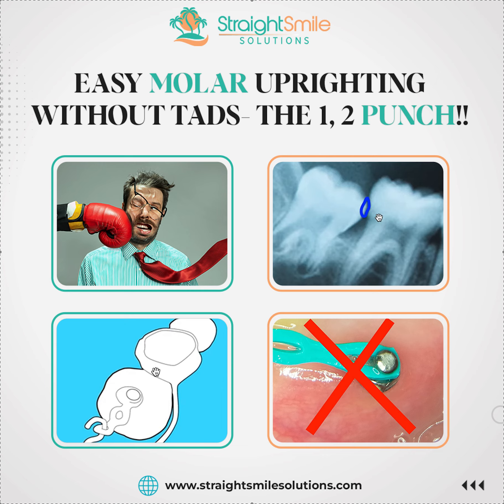If the second molar starts to get caught on the band, you might have to use the spacer technique — I have individual videos about both the Halterman technique and the spacer technique on my YouTube channel. It does work as long as conditions are met. I can't promise it will be perio-problem-free — you might get a perio defect, especially if you go too rapidly. I reactivate this every few weeks in office. Depending on angulation, it will take four to twelve months. Once you get it up to the height of contour, you can start the spacer technique and you're essentially done. Yes, it's uncomfortable and pokes the patient, but it's much more comfortable than a TAD, much cheaper, and much healthier.